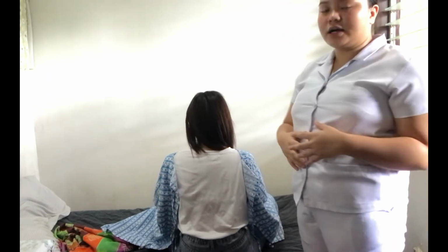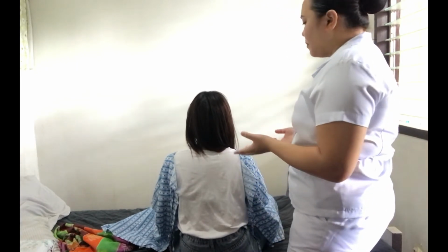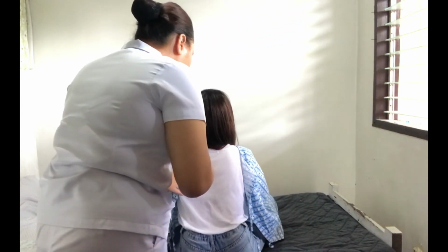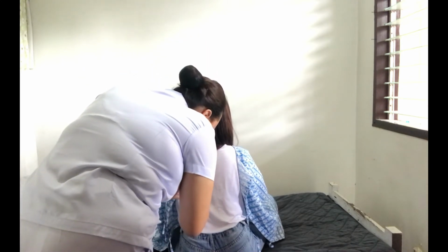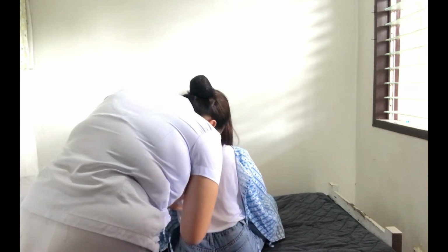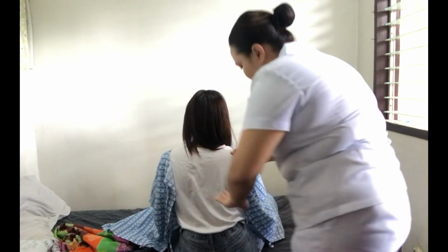So let's now proceed to the measurement. I'm going to write something, a mark, on your back, Queen. So can you inhale and then hold it for me? Now inhale, and then can you hold it for me? Now inhale. Can you hold it for me? Now to the other side.